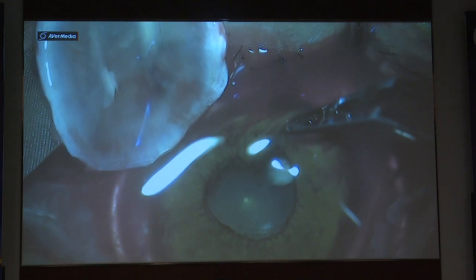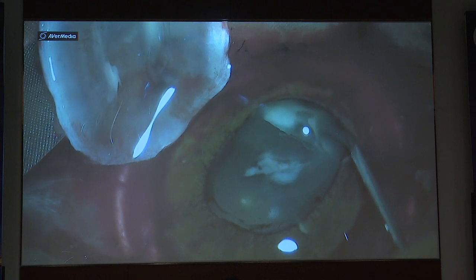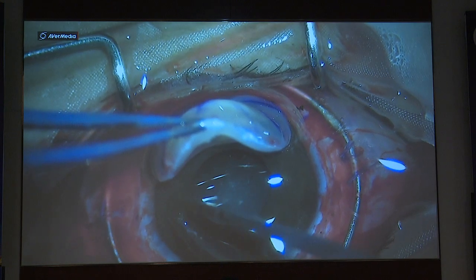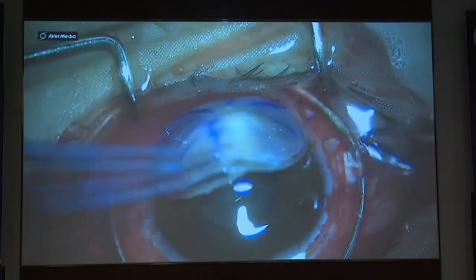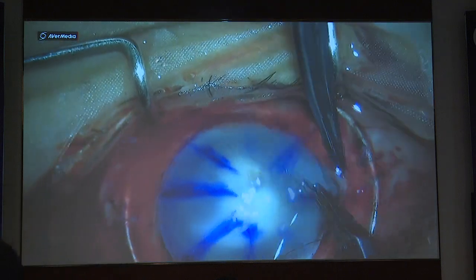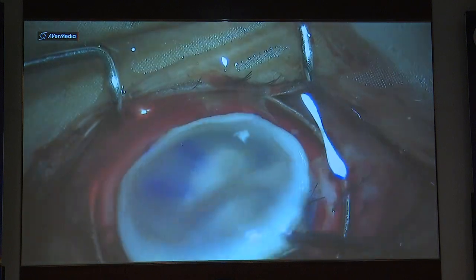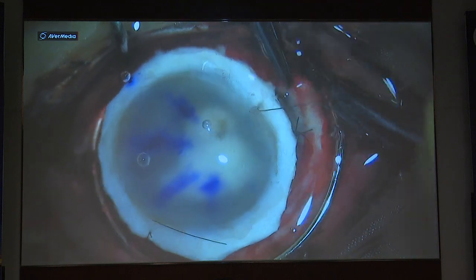Looked at the equator because sometimes when we remove the iris and there's a long-standing hypopyon, these exudates might reach up to the pars plana, which requires a lensectomy, vitrectomy. Coming back to my case again, inflammatory membranes over the iris were removed, and now started the positive pressure. The graft was large, patient was young, mannitol was given, but still there was a very high risk of expulsive hemorrhage. So I sutured back the host and now put viscoelastic over the host and placed the graft over the host and sutured at 4 new quadrants.